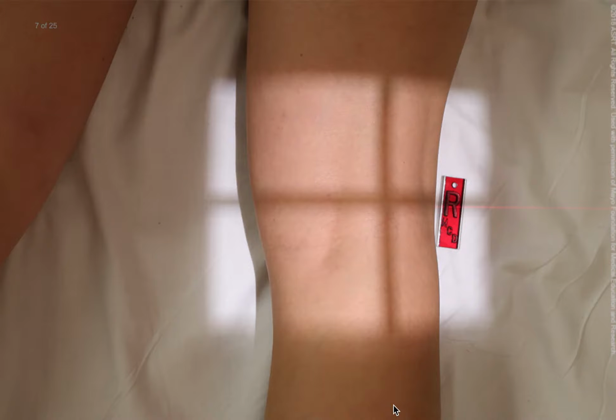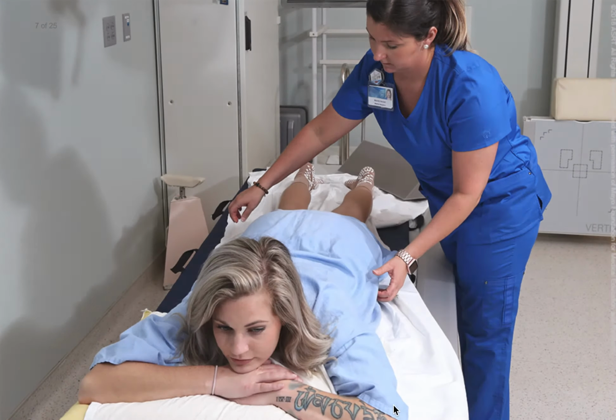A PA projection of the patella generally is preferred over an AP projection because it positions the patella closer to the image receptor, thus improving detail on the finished radiograph. Positioning for the PA patella projection begins with the patient prone and the affected leg extended. If the patient is in pain, place a thin positioning sponge under the thigh and lower leg to take pressure off of the patella. The image receptor is centered under the patella.